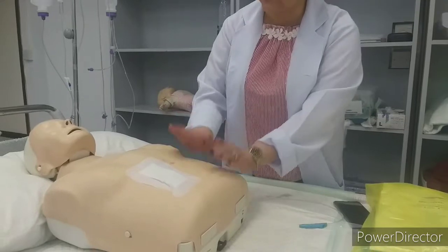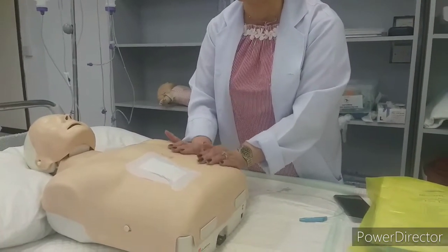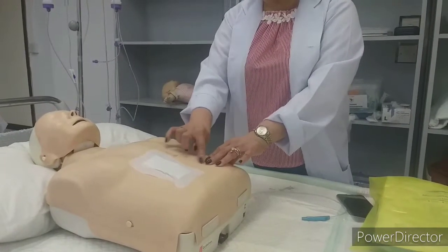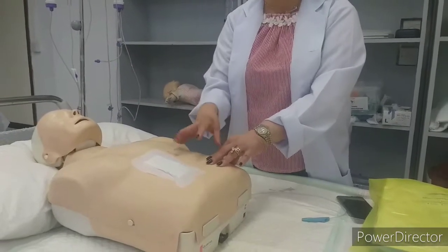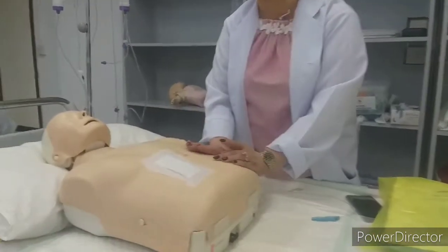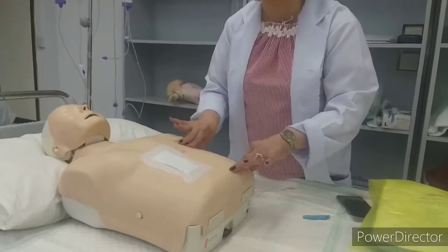Dry. This time, here should be very, very, very dry. Because if it always leaks, you know, the poo-poo here, even with the bag, it always leaks. Not unless it is good skin.